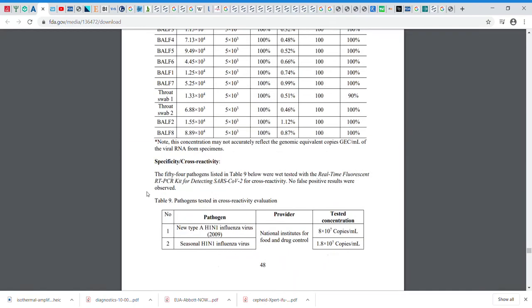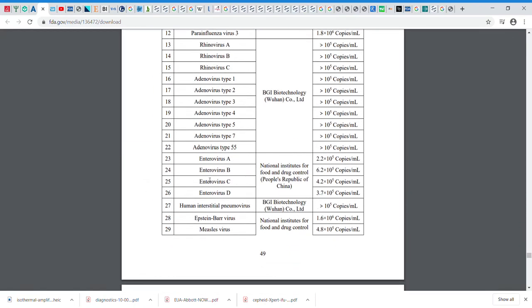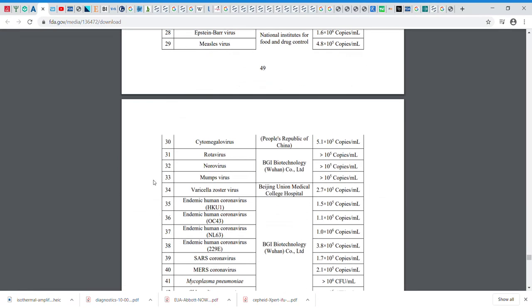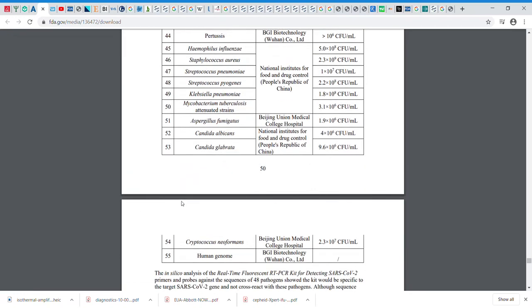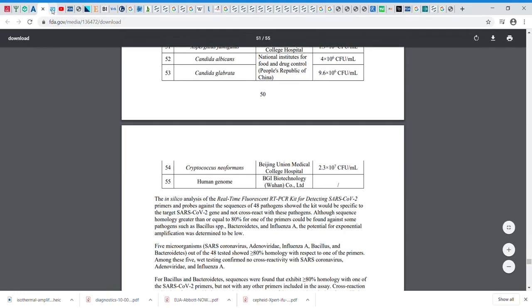Lots of information on testing. What else do they test on other things? Okay, and how much exactly of these other viruses, to make sure you don't get a positive result just because they have other viruses? This is really wonderful, but it's meant for a lab, not for normal people to use.